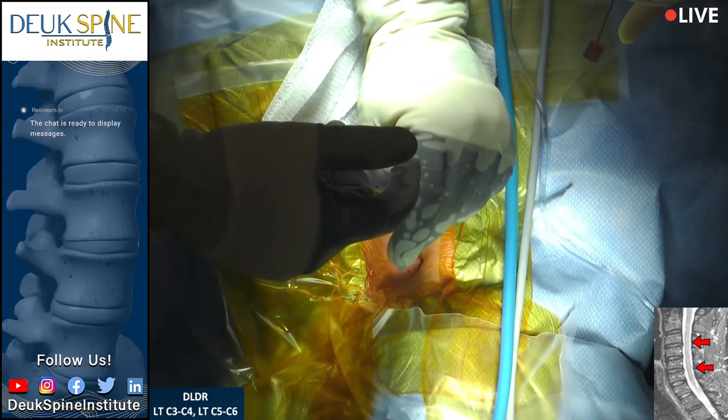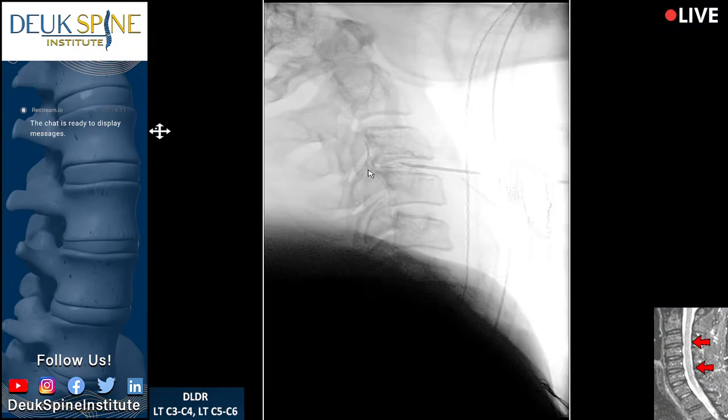Let's show the audience the tear — you can see it. Look at the herniation right there. That is the tear in the back of the disc. The herniations are bigger than you see on the MRI. The reason there are two humps is that if the fluoroscope is not lined up perfectly lateral, you'll see a double hump for herniations on both sides — a left and a right herniation at the back of the C3-4 disc.